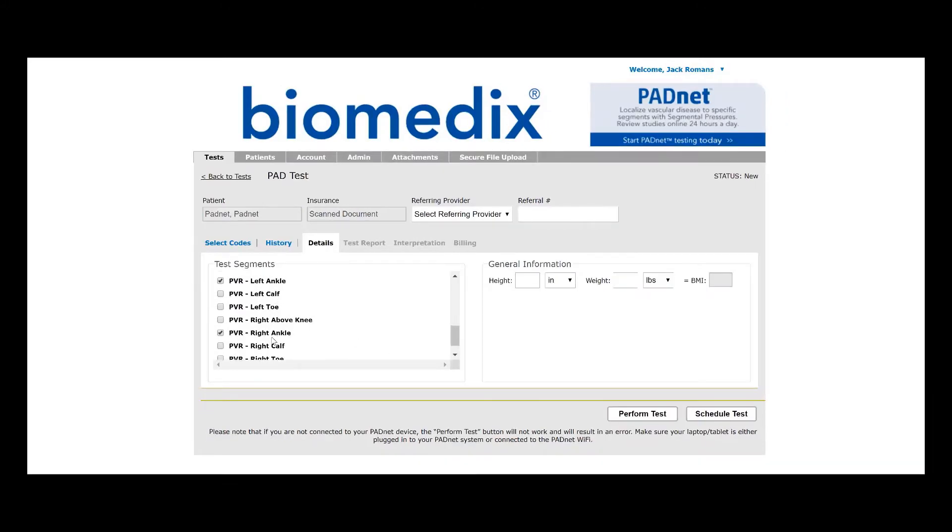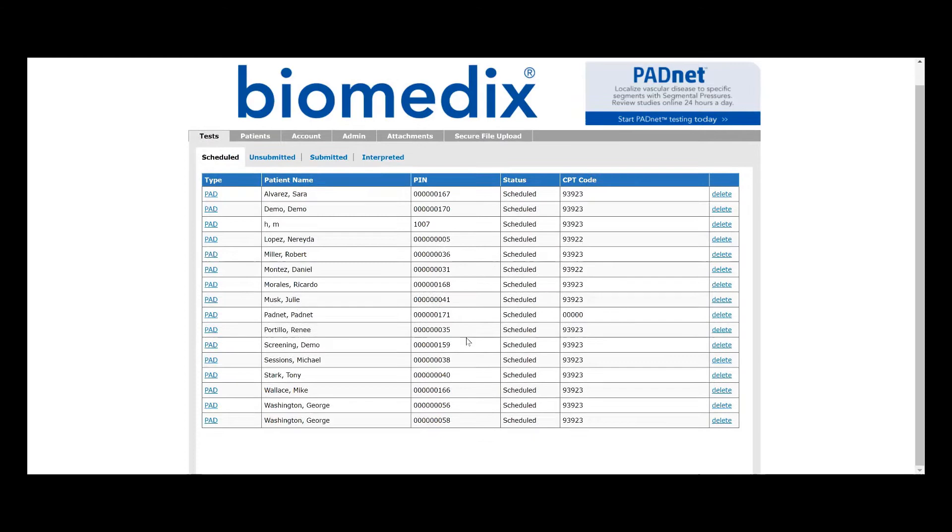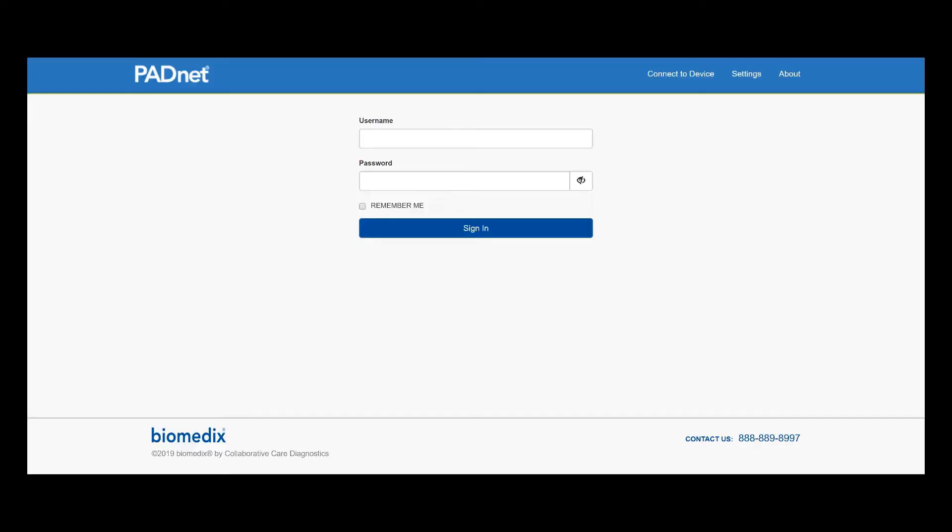Of course, you add height and weight as you did before over on the right-hand side. Now that we have our test scheduled for PadNet PadNet, again, we'll notice that it's scheduled as a screening, even though we will ultimately bill it as a 93923.